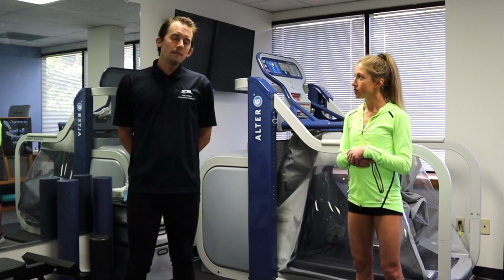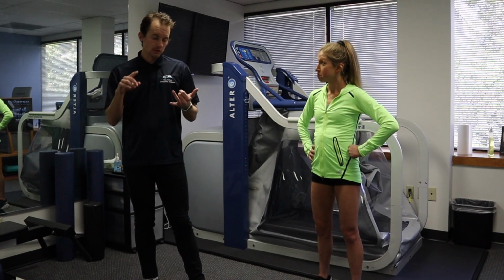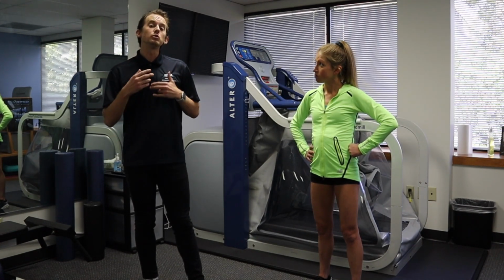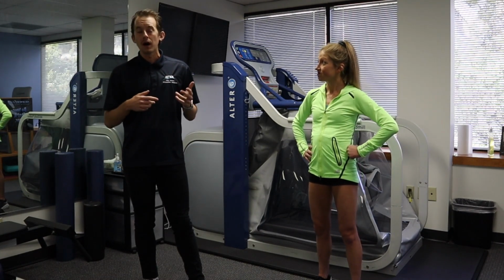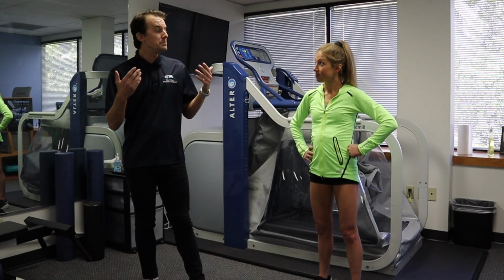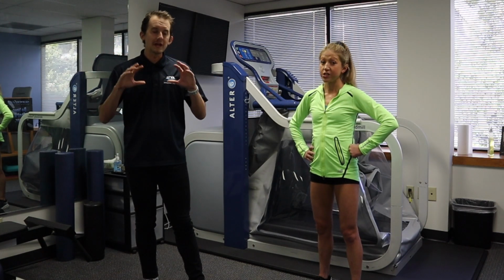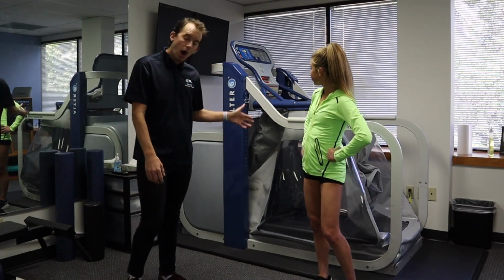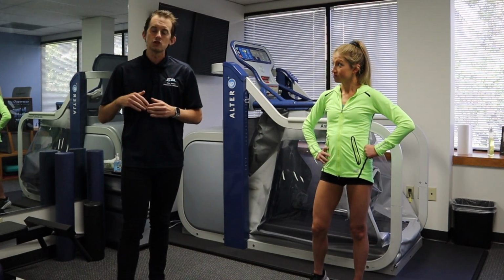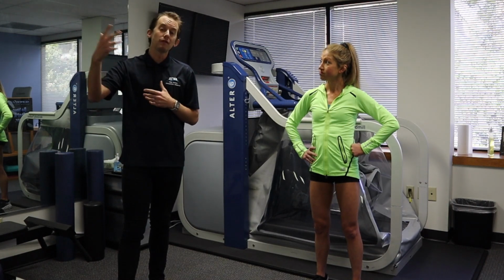Yeah, great question. So another injury or condition that we find the AlterG very valuable is anyone after surgery. So any sort of knee injury, think lower extremity surgery, knee injury, hip replacement, knee replacement. After those types of surgeries, it's essential that someone starts moving whenever they get the clearance, often less than a week after the surgery. If someone doesn't start moving in a controlled fashion, you can build adhesions and actually cause the rehab to be stalled. So on the AlterG, it allows someone to walk in the beginning safely, just get the lower body moving, and then just like I mentioned with the bone-related injuries, slowly bring more weight on, slowly increase the speed, slowly bring the variables up, and help them recover faster after their surgery.